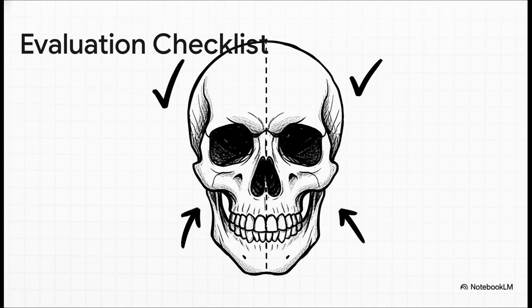collimated field. We also need to see the entire cranial perimeter showing 3 distinct tables of squamous bone. And finally, that nasal bone acts as a great indicator that absolutely no rotation has occurred. It's a rigorous checklist for sure.